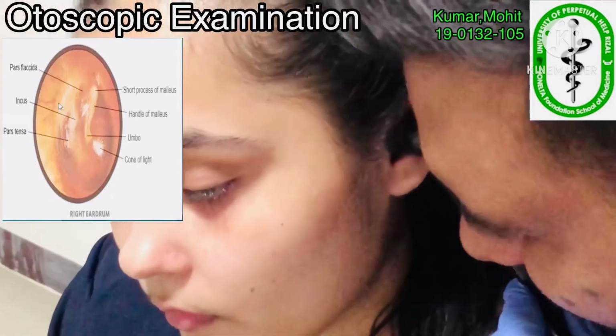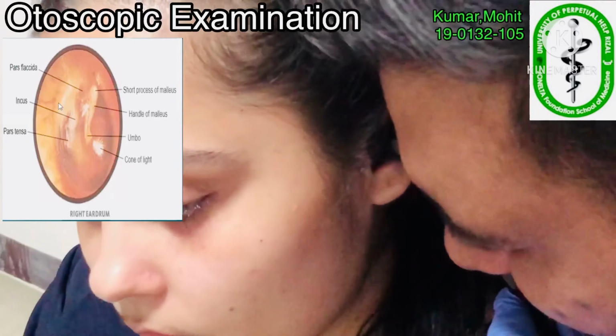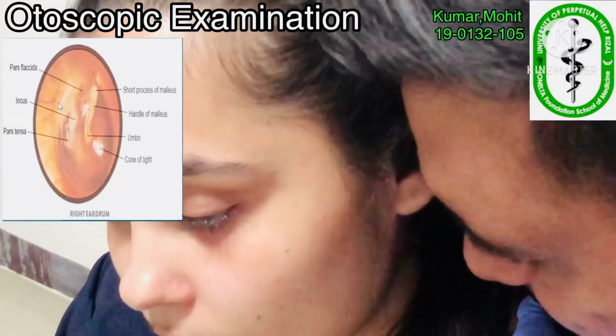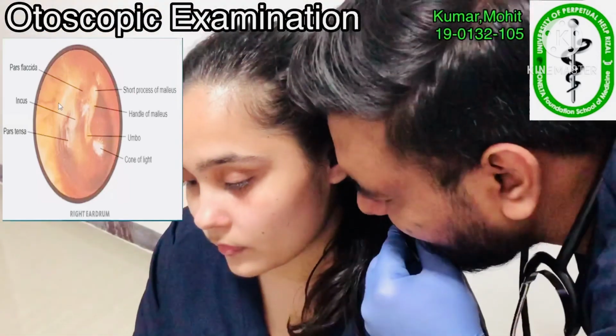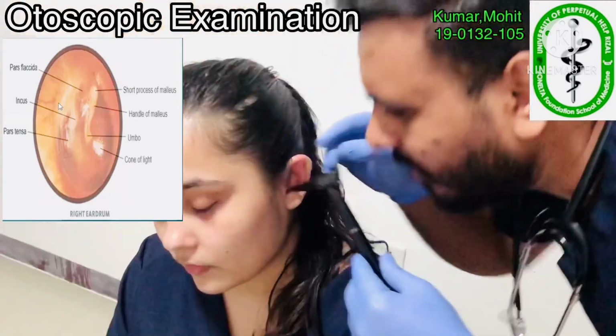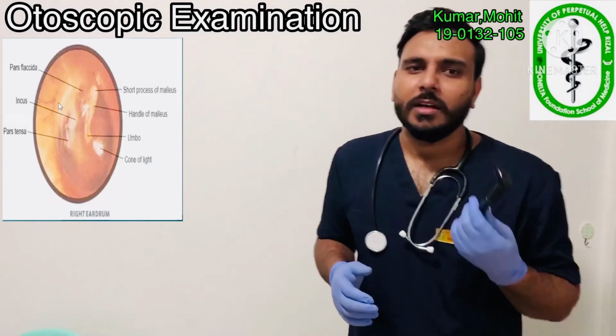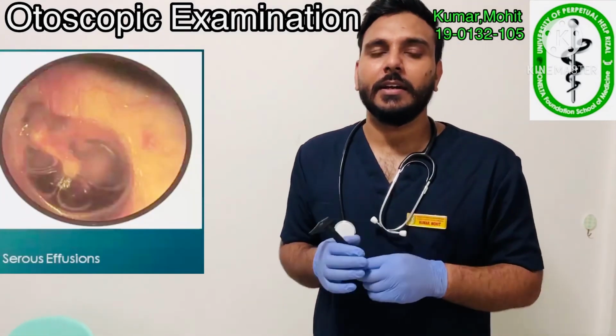We have to look for deformities inside the eardrum and the ear canal, and we have to look at the color of the eardrum. We have to observe with the otoscopic examination. We have to see the eardrum and the ear canal.